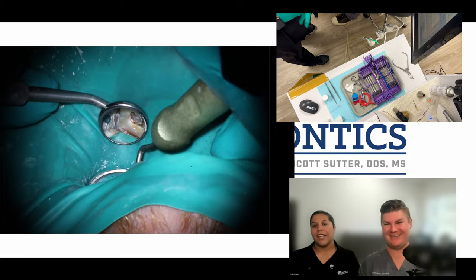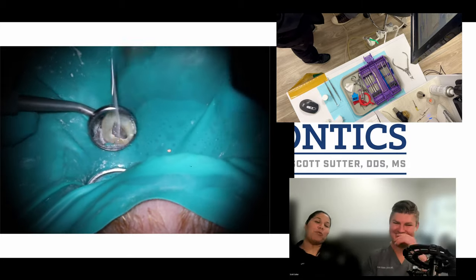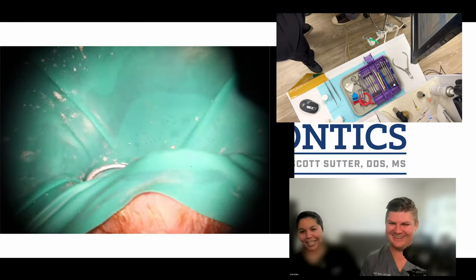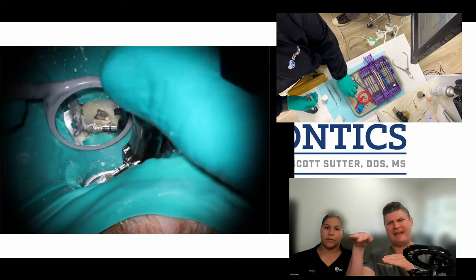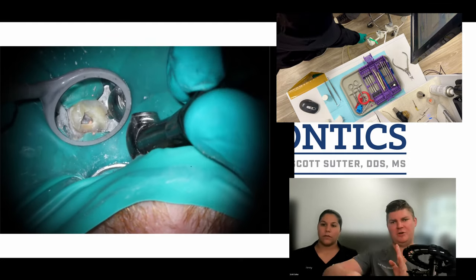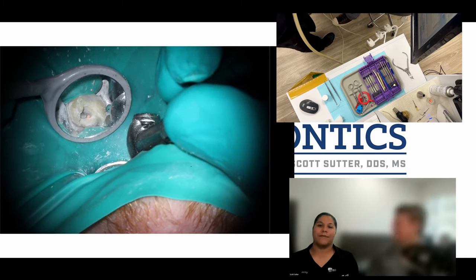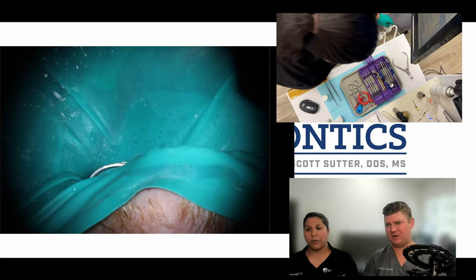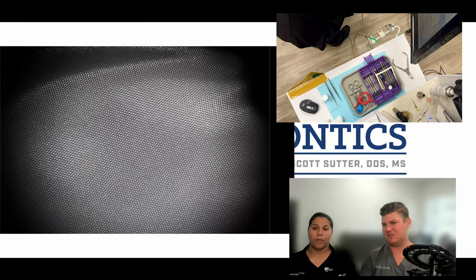She's got the software ready to take the x-ray, the lead vest on the patient, the sponge prepped and ready, and a cotton pellet ready to smooth off the cavity after placement. She's standing on a box because she's actually really short — she got blurred out by the camera. We've taken the photo, everything looks beautiful. I'm going to come back in and smooth off a couple of sharp spots because with that flat angle, I don't want to leave any right angles that are going to be sharp to the patient's tongue. Since I'm not doing the restorative, it's nice to take that barrel burr and buzz it around the outside and along the chamber so everything's smoothed off — I was tired of getting those phone calls. That's a pro tip.